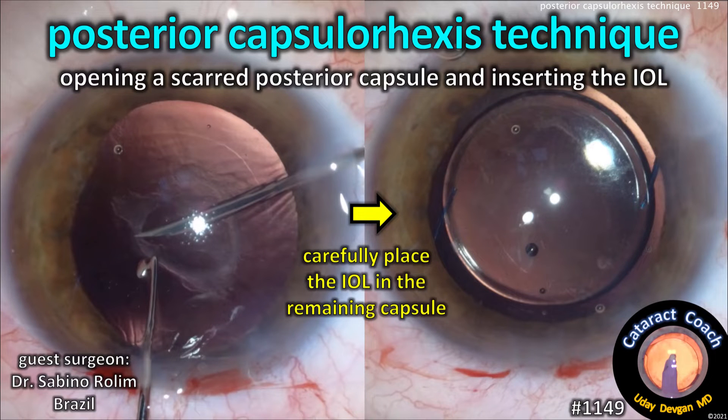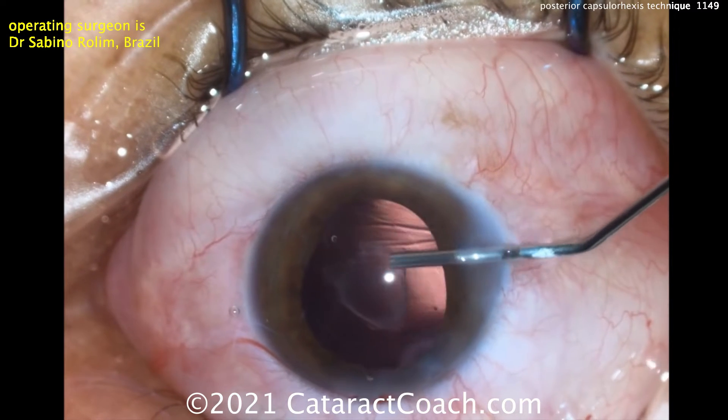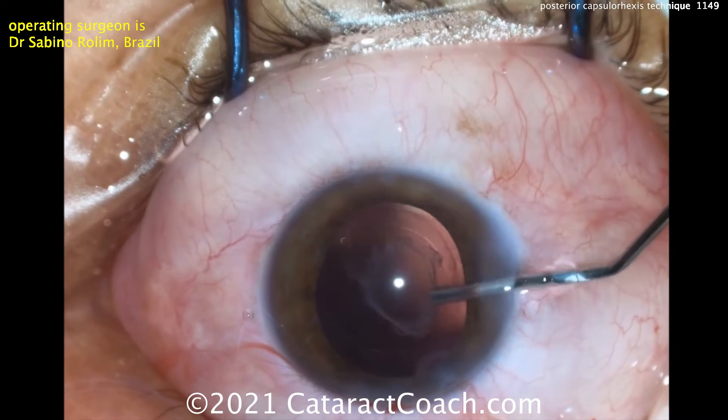CataractCoach.com presents the Posterior Capsular Rhexis Technique: opening a scarred posterior capsule and inserting the lens. This is a tough technique, but it's something that's important to learn. Our guest surgeon here is Dr. Sabino Rolim from Brazil.